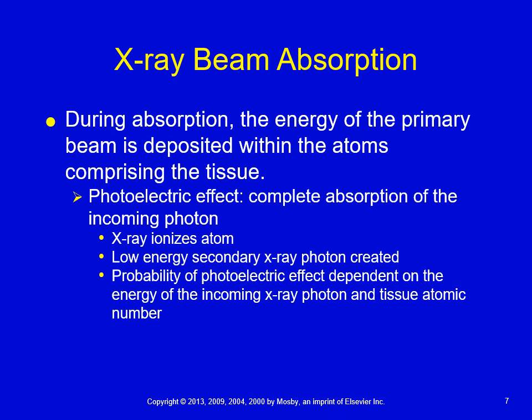When X-ray photons enter the patient's body, a few different things can happen, but one of the things is that it can be completely absorbed, meaning the X-ray photon that enters can be completely absorbed. So that's what we're talking about right here with the photoelectric effect. With this particular interaction, we have an X-ray photon or photons coming into the patient's body.